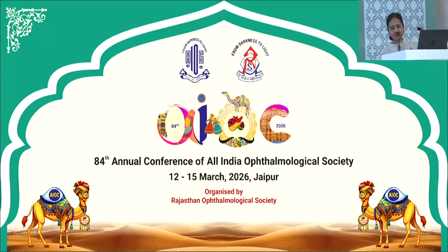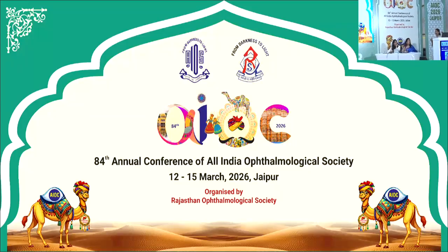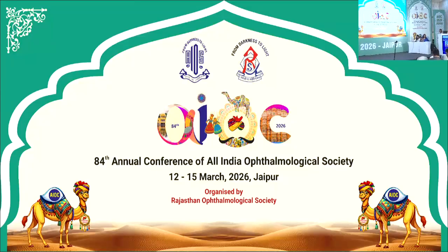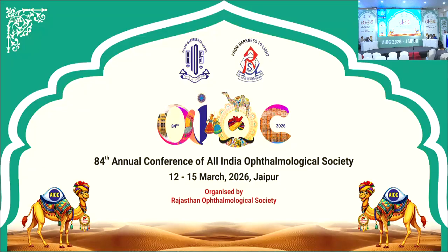Sir, I have seen people usually use pupil dilator hooks. They still don't use the Malugin ring or the B-hex ring for dilating the pupil. Second thing, in glaucoma patients, the chambers are very shallow. So when we are doing a phaco, we have to be very careful to fill the chamber with a viscoelastic and use a rhexis forceps instead of a cystitome.